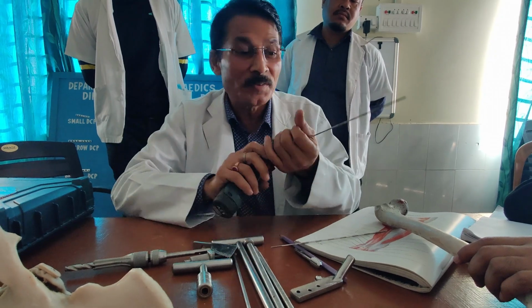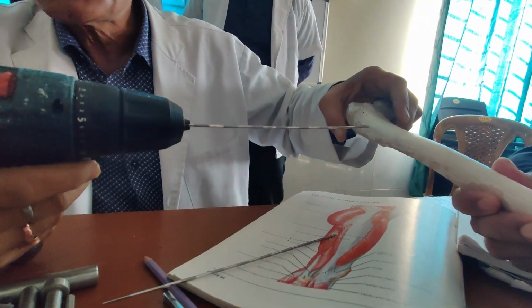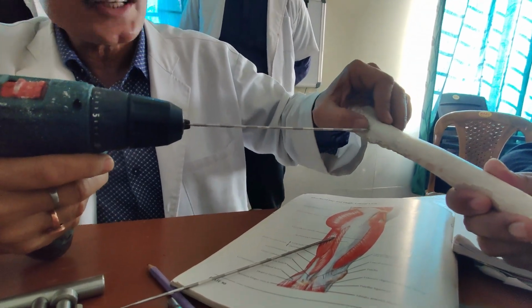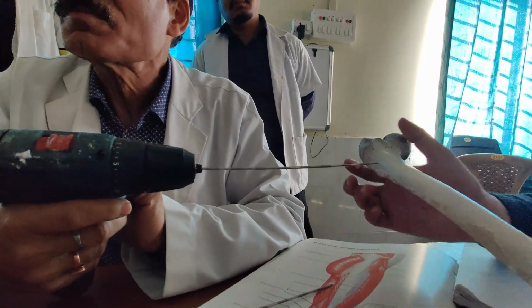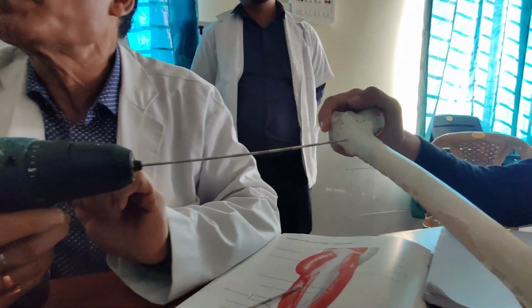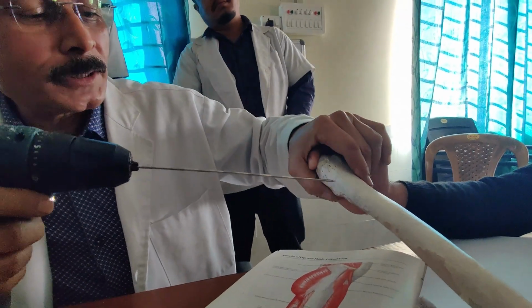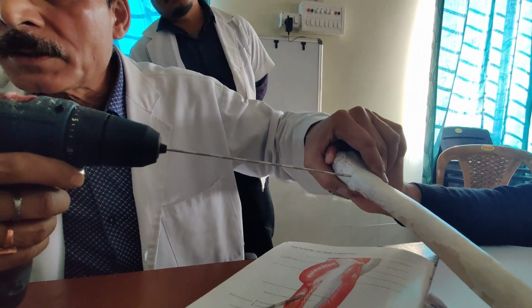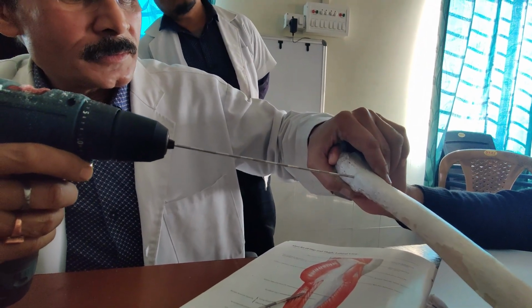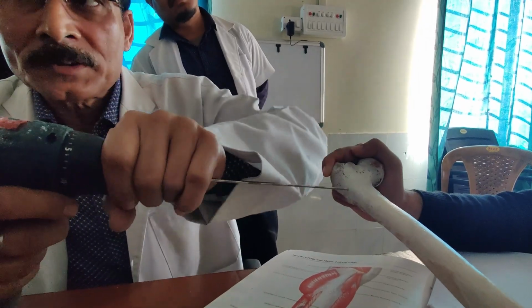It may sometimes be difficult to penetrate this area, which is particularly strong bone. So take the help of a drill bit and make a hole here. Initially you can start at a point like this. Suppose this is the guide wire there. Now, after entry, you again have to angulate it.